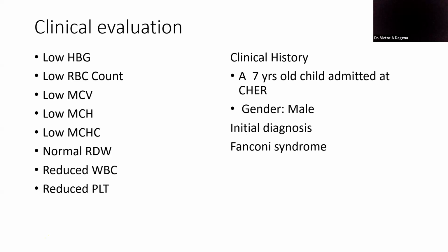So that was why I chose this very full blood count for us to have a thorough discussion about Fanconi syndrome and its relation. So, any question? I'm waiting.